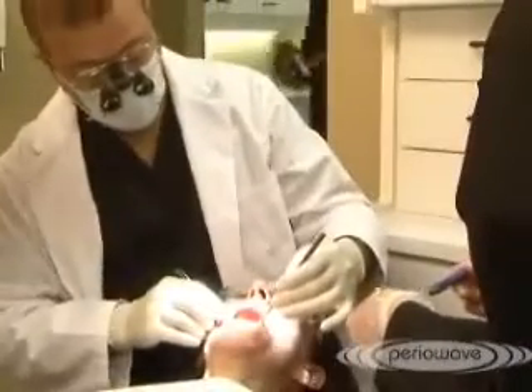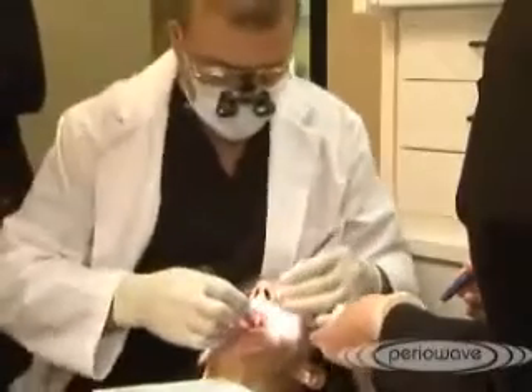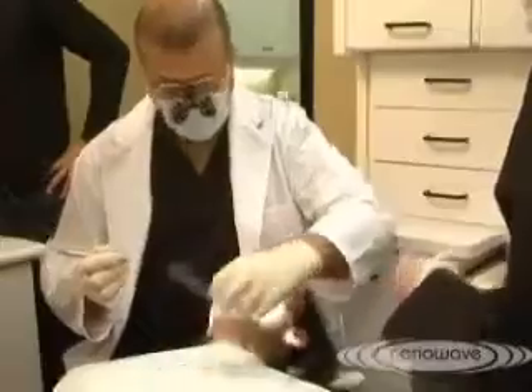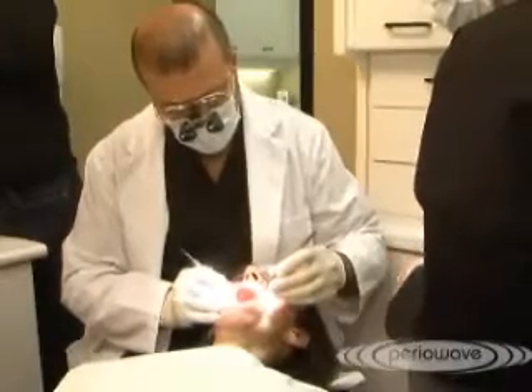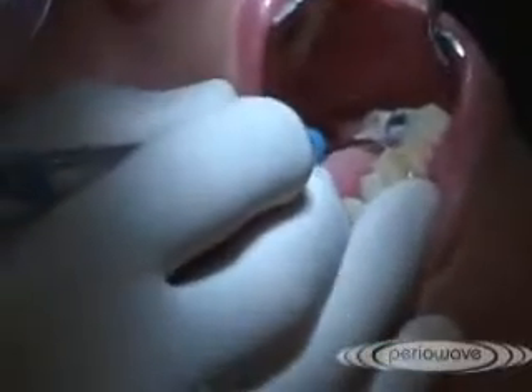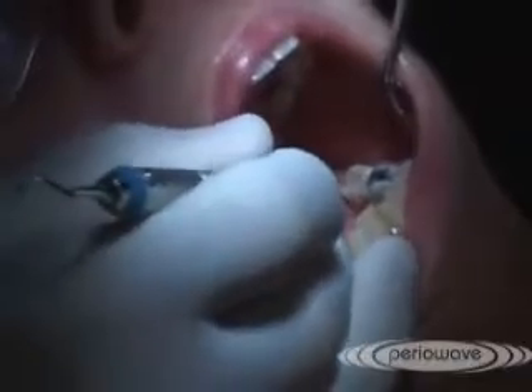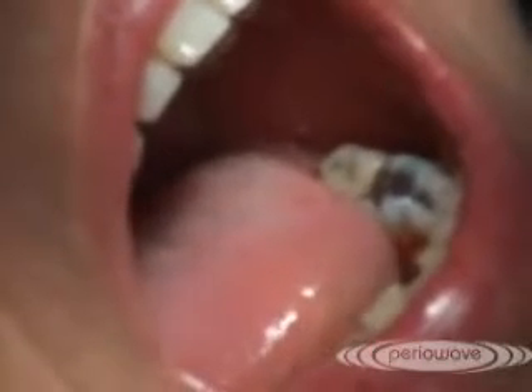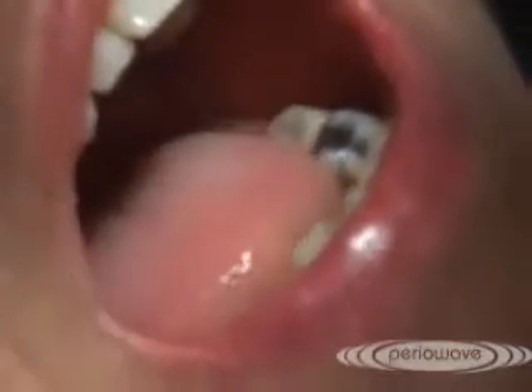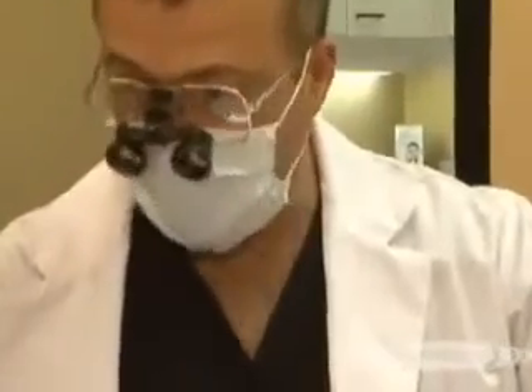We're very concerned about the periopathogens entering into the bloodstream. So we're going to do a pre-treatment with PerioWave to not only control the bleeding but to kill the bacteria before they get a chance to enter into the bloodstream. What I'd like to demonstrate now is some initial scaling so that you can see the difference between the before and after treatment. As you can see, there's continuous bleeding there, and that was with a light scaling and root planing. Knowing the amount of bacteria that resides down in those periodontal pockets, we know that the deeper the pocket, the more the bacteria. We want to try and control all that before it enters into the bloodstream. So we're going to go ahead and start to pre-treat, then return to scaling and root planing, and you'll see the difference with not only the tissue but the amount of bleeding.